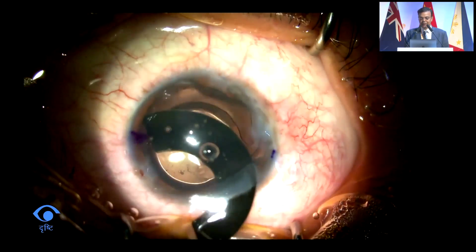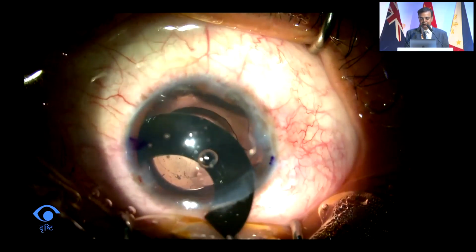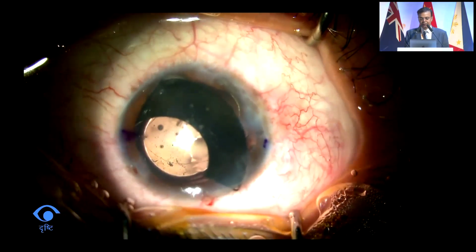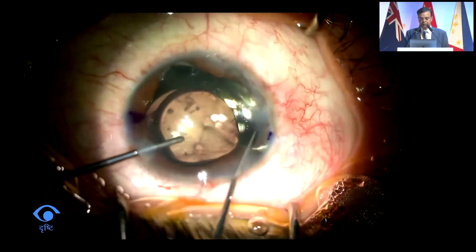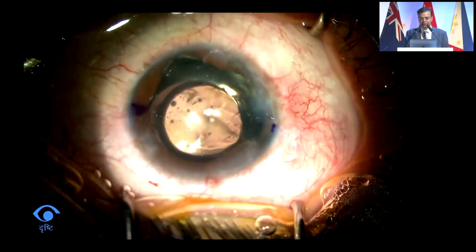And these implants are very brittle, and they can very easily break. So we had a standby implant as well. And you can see that finally, after a lot of manipulations, we were able to get this implant in and position it correctly into the sulcus. So there it now sits in the sulcus, and it's nicely closing the defect.